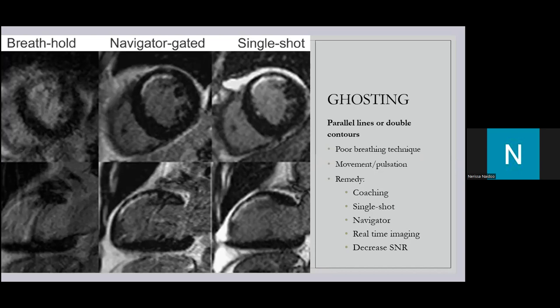We can also use real-time imaging, but we must be aware that this increases the scan time and decreases the signal-to-noise ratio. I have used it personally in extreme cases where that was the only way we could get any sort of imaging, and it gave us a fair result.